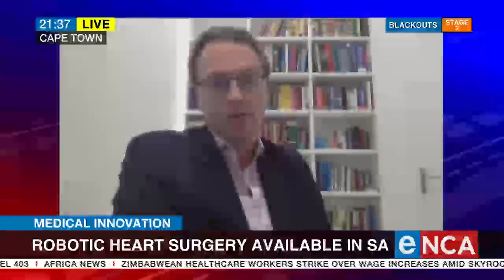And from a heart surgery perspective, the big application of robotic surgery is in coronary artery surgery, where we, with very minimally invasive techniques, harvest important conduits from the chest that we use then to bypass blocked blood vessels on the heart itself. And this is technology that's rapidly developing, and we're looking forward to an exciting future in robotic surgery internationally.